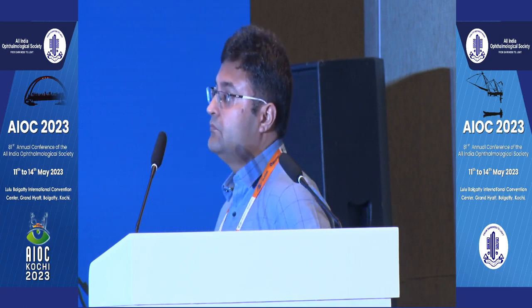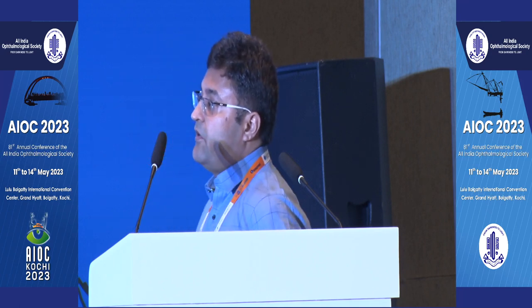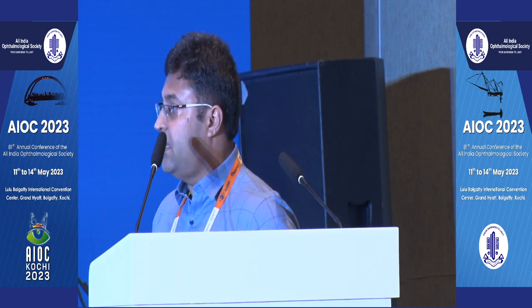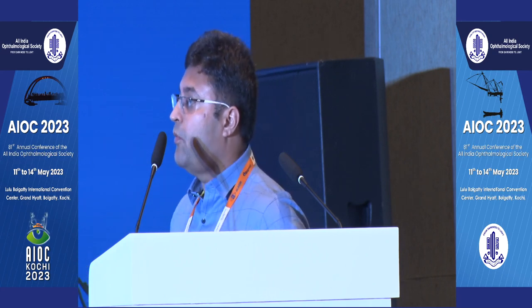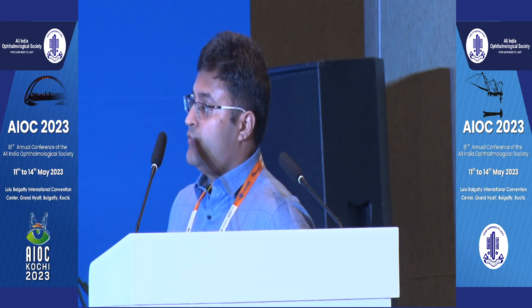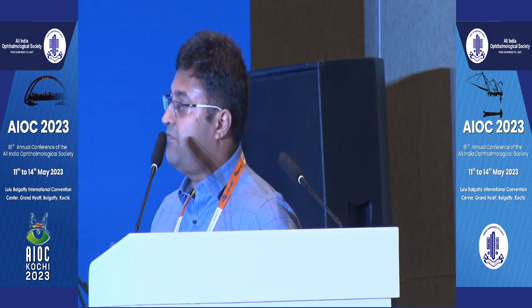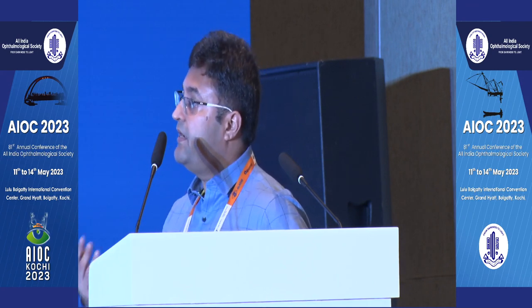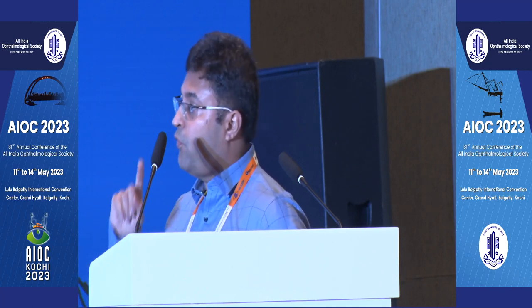And Saumil, any timeline to do this surgery? I mean, when you see a CRAO case? So time is of the essence here, and even then the results are unpredictable. In my case, I operated on the patient within 18 hours and it was very difficult for me to get a cardiac fitness, because usually these patients have comorbid conditions like heart disease. So usually anything that you operate on in less than 24 hours, you assume that the retina has not already got infarcted by the time you enter. But there is again no predictability on that. I have operated on cases more than 3 days later and I've got back vision, and I've operated on some cases 4 hours from the time of the occlusion and I have not got back vision.